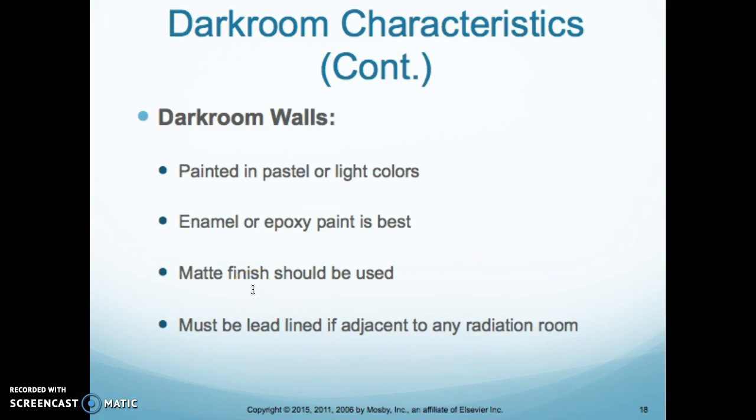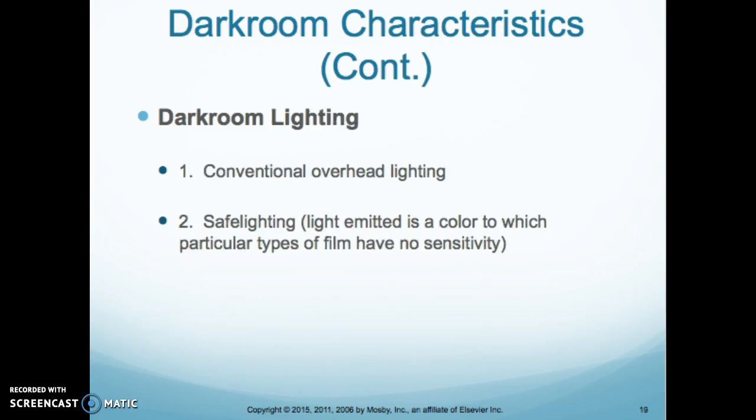If you're next to a radiation room or a nuclear medicine department, you're going to have to put lead in that wall, or else it's going to fog your film, because as you recall, I said earlier, once the film has been exposed, it's 2 to 8 times more sensitive than it was before it was exposed. So it's really, really sensitive once it gets to that darkroom to be run.